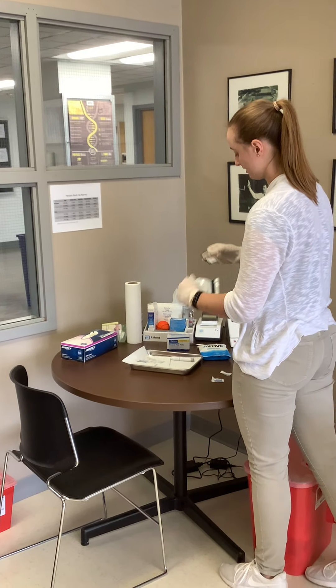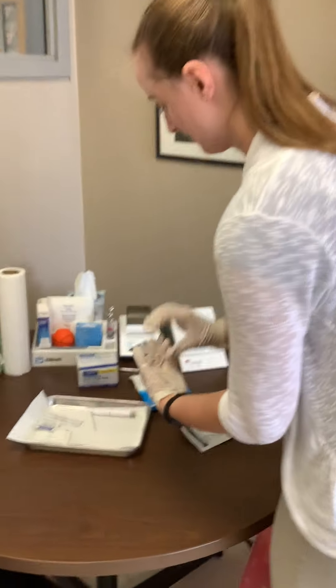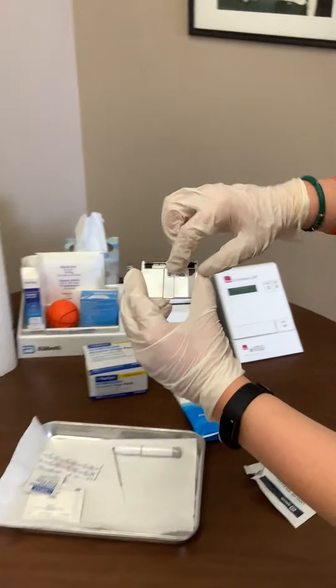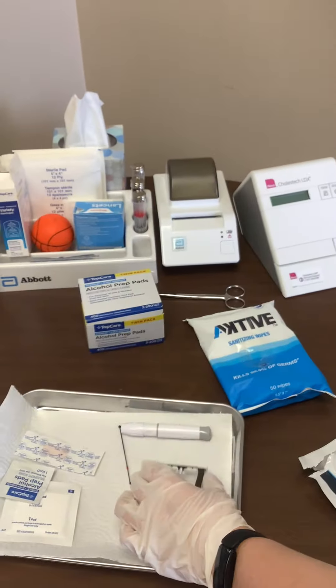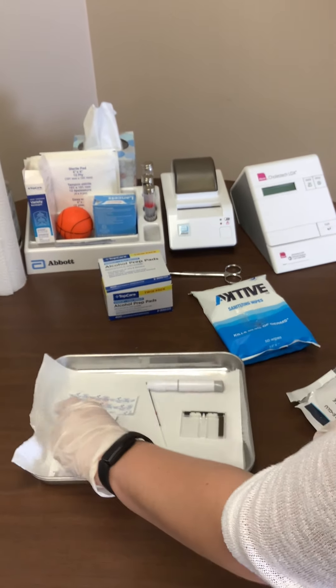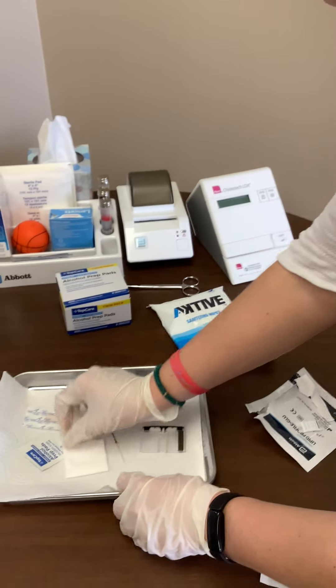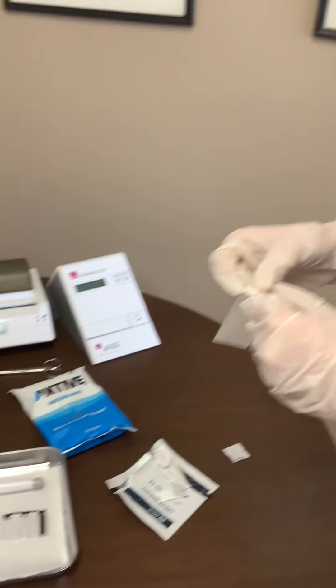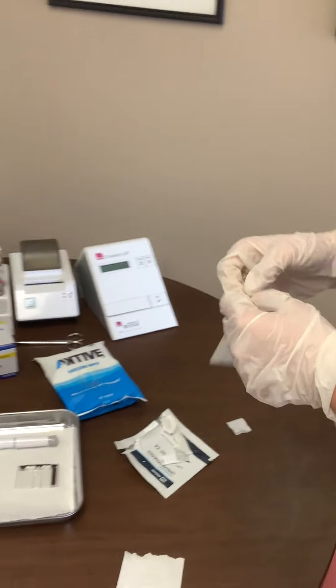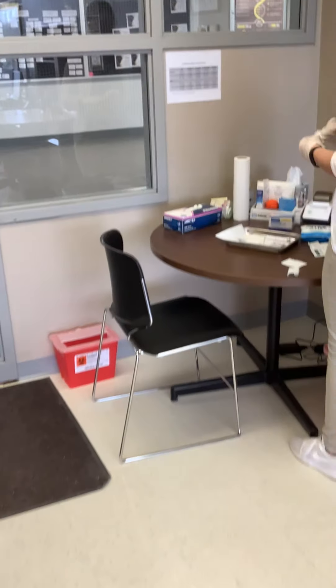Open the lipid cassette — the outer packaging is trash, you don't need that — and then set it up with the opening on the top like so. Just set that down. You'll open up the gauze, the band-aid, and really everything else you need. Once your participant feels good and ready with a warm hand, you'll have them come take a seat.